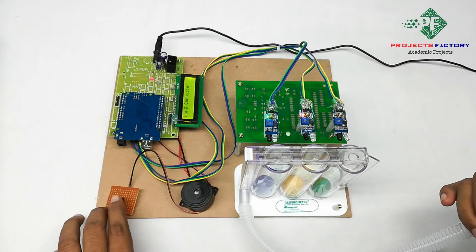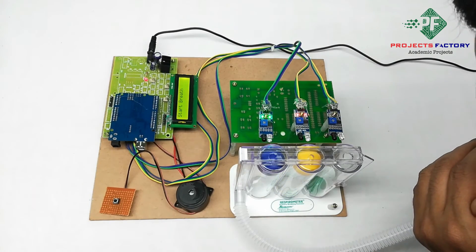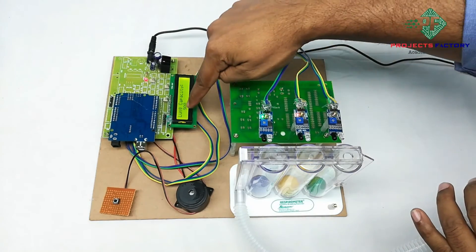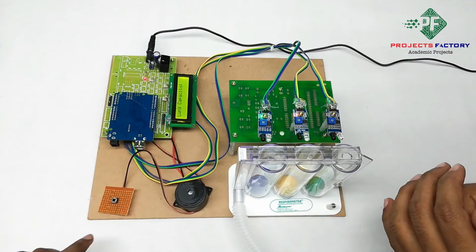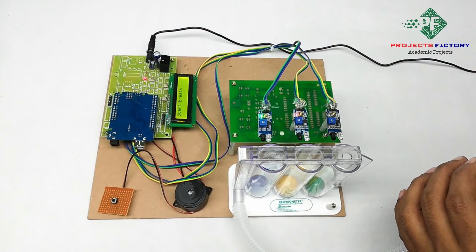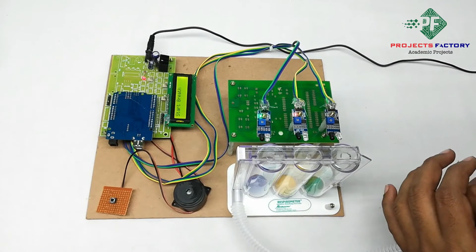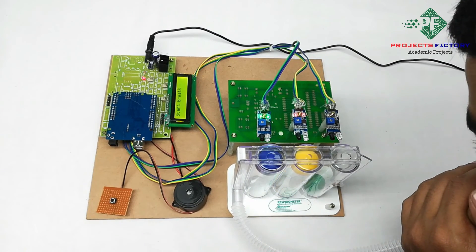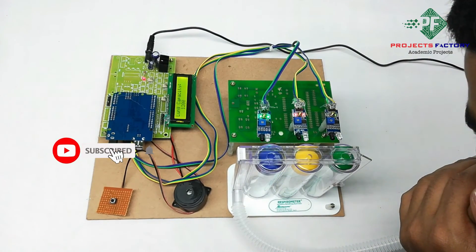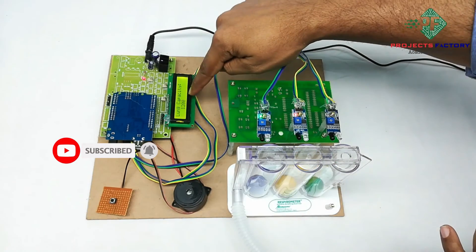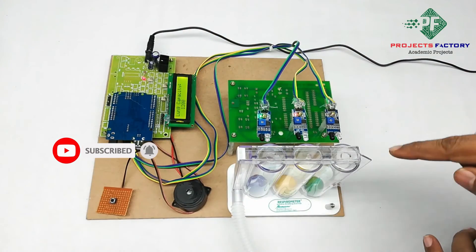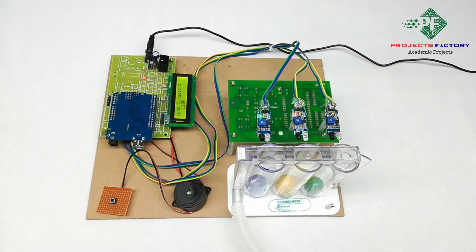Again we press this button. Two balls: 900. Lung capacity 1200 for three balls.